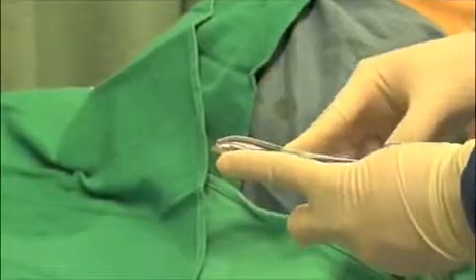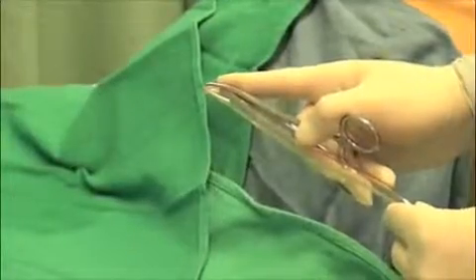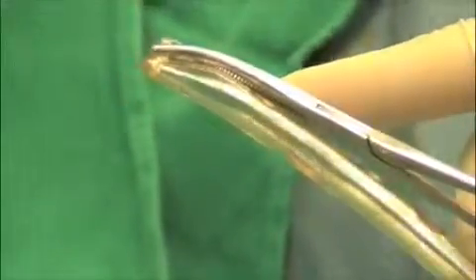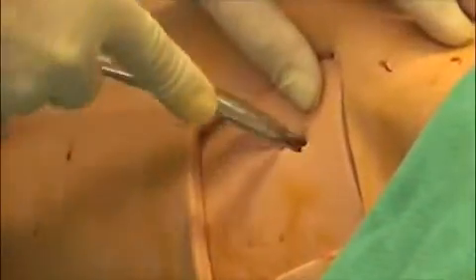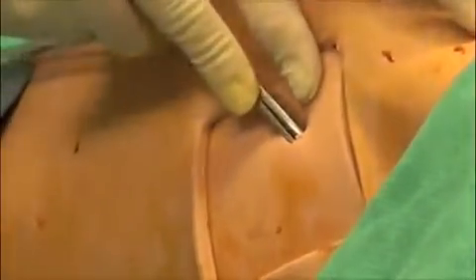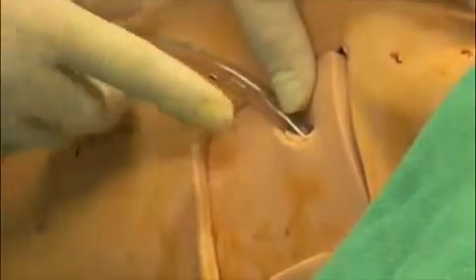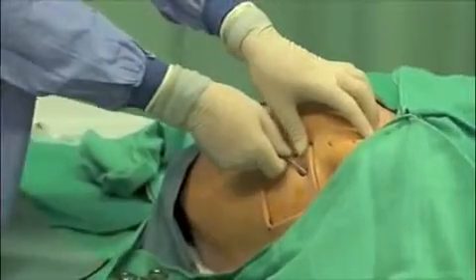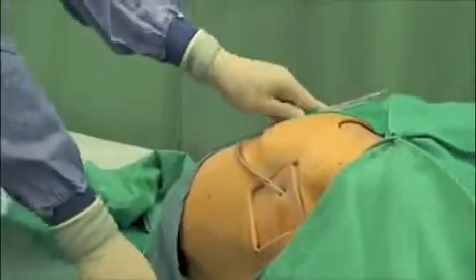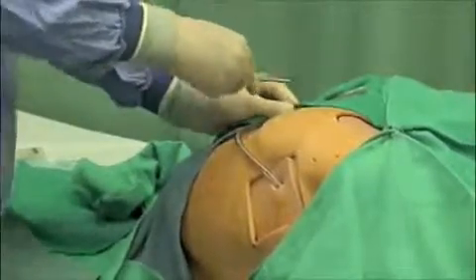Using the curved forceps, clamp the end of the chest tube with the drainage holes. Place the tip of the tube into the pleural space. If possible, you may use a fingertip to guide the tube insertion. Release the clamp and advance the tube superiorly and posteriorly to the desired depth. Ensure all drainage holes are within the chest cavity. Look for fogging of the chest tube with expiration and listen for air movement.